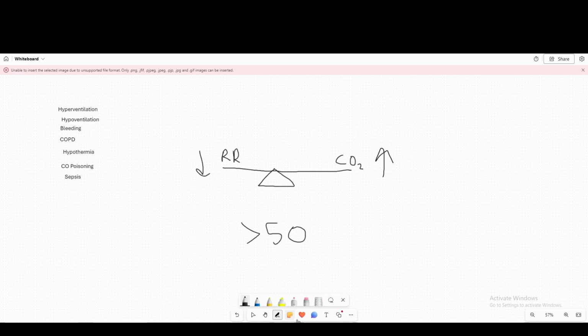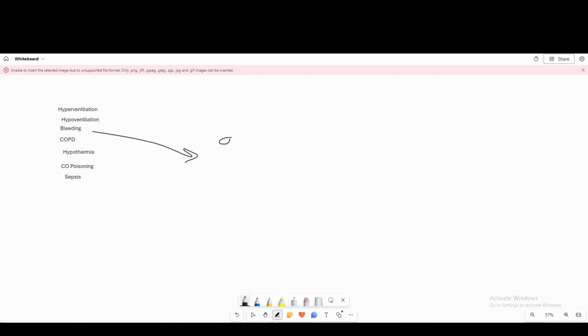Next up, onto bleeding, right? So in a situation where you're bleeding, you can see things like a high SpO2 reading. This might be a little dramatic, but okay, why are we going to get maybe a falsely high reading when in reality it might be a lot lower than that? So when we bleed, we're losing blood, right? Which means we're losing hemoglobin, which means that this 99% is saying, hey, 99% of the blood we have left is saturated.